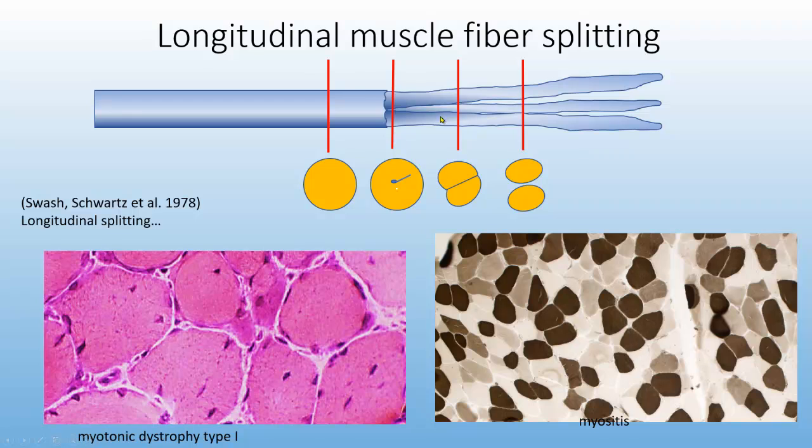And they could see that the muscle fiber often showed a splitting phenomenon. It often started where there was a central nucleus, and you could see a small split. If they cut a little further down, they could see that these must be parts of the same muscle fiber, and if they cut even further down, then the two branches looked like separate muscle fibers.